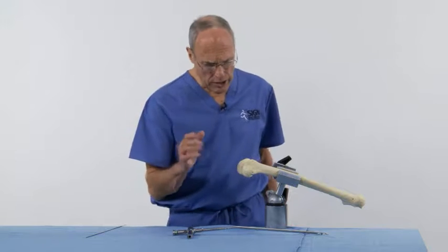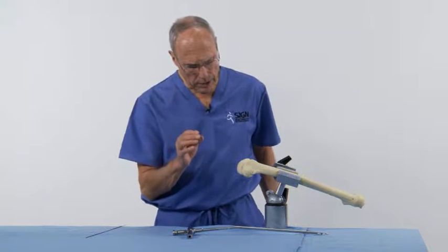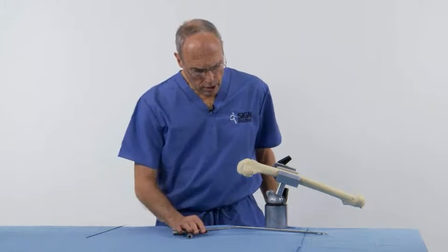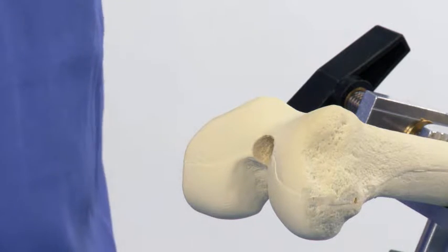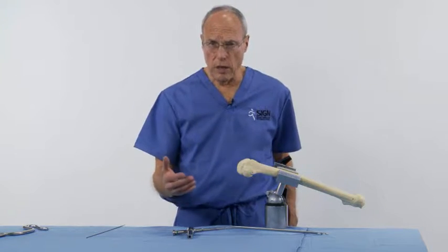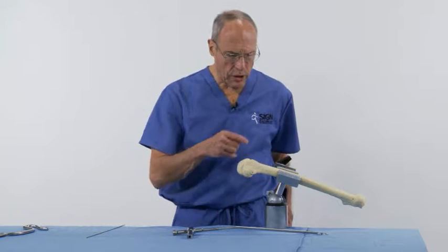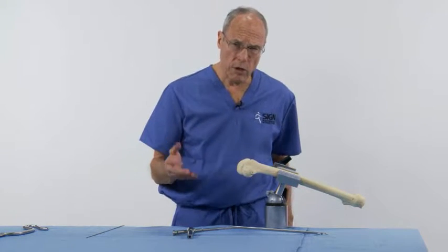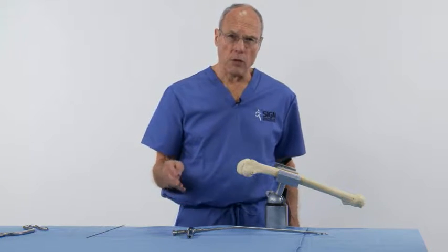Sometimes when I can't see the femoral groove well, I make an indent with the alignment pin and feel the indent and then use the curved awl to make the bone entrance. Here's the curved awl. Once the bone entrance has been made, and you're going to do a closed reduction, direct your reamers through the metaphysis into the diaphysis. I'm seeing more and more distal femur fractures treated without a C-arm by closed reduction.